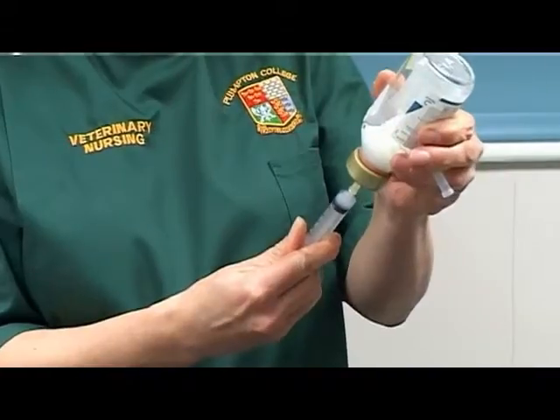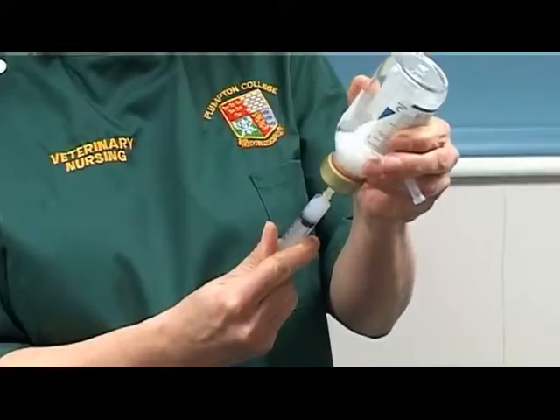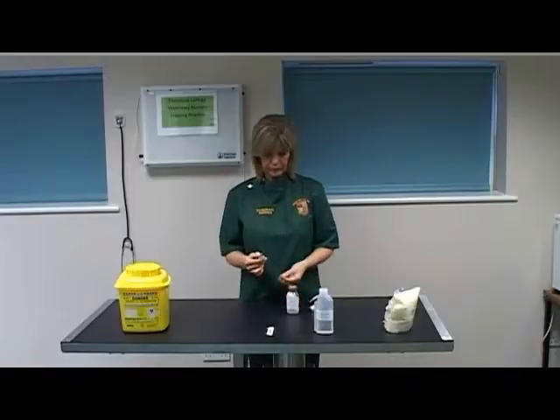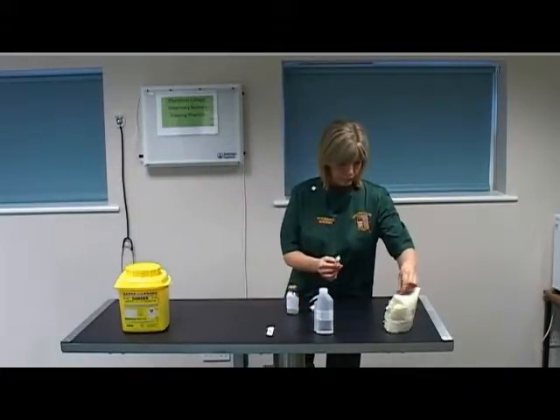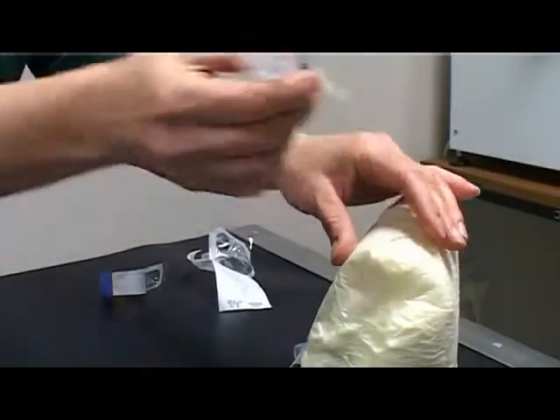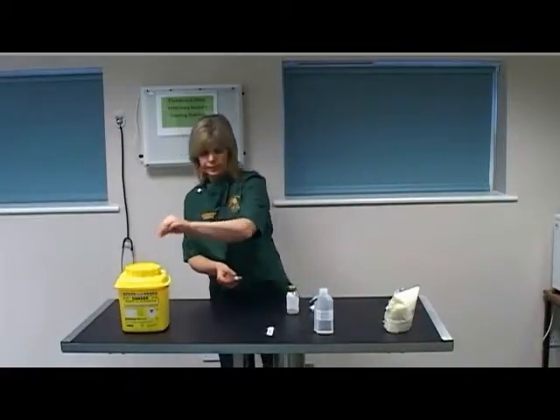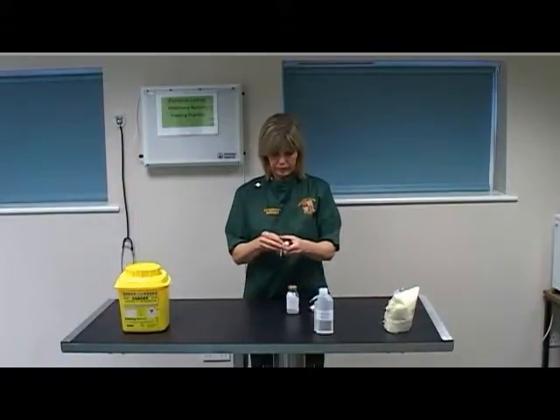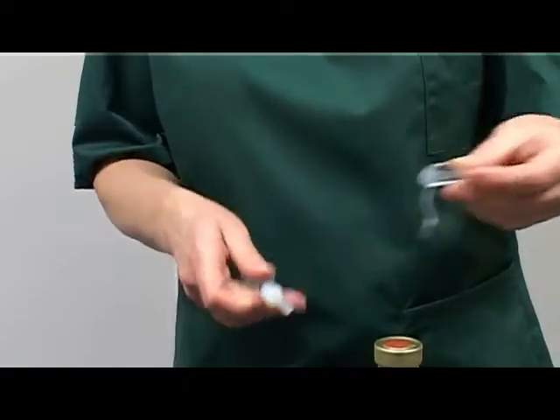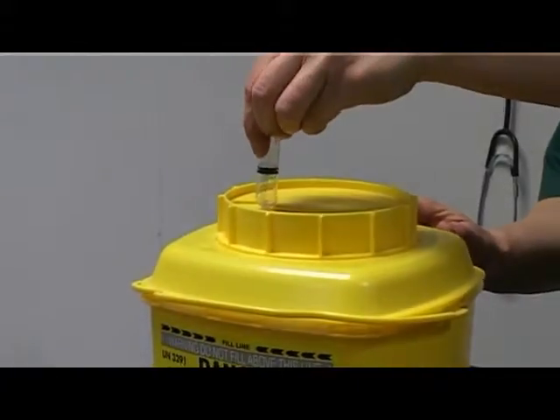Draw back the correct volume of drug required. Withdraw the needle from the vial. Change the needle and dispose of appropriately — the needle can either be re-sheathed safely using a foam block, or the unsheathed needle placed directly into the sharps container.